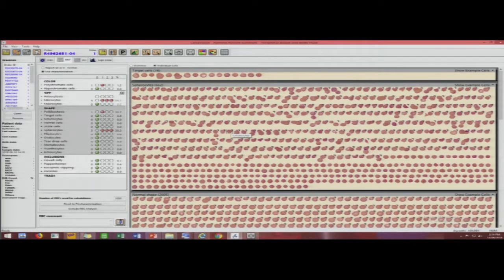This is another view you can get — all the cells are laid down in rows for you to see how these cells are. This is another case in which there were spherocytes again; it's just the way it is expressed is at the comfort level of the viewer.